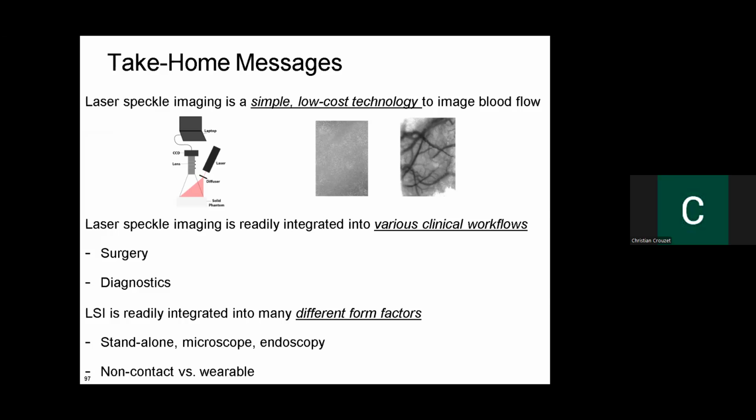I believe that they had a liquid-based phantom for the commercial systems that they would get.